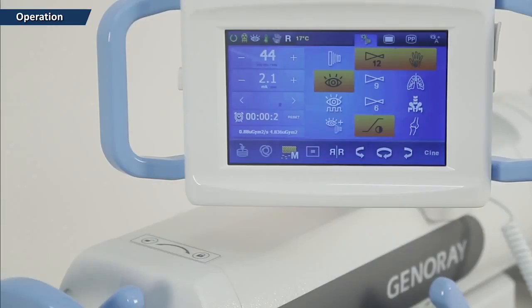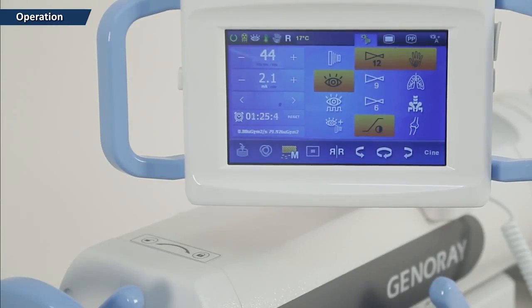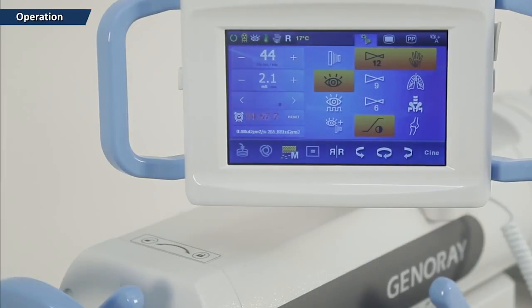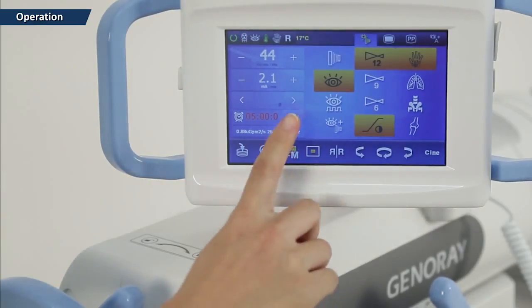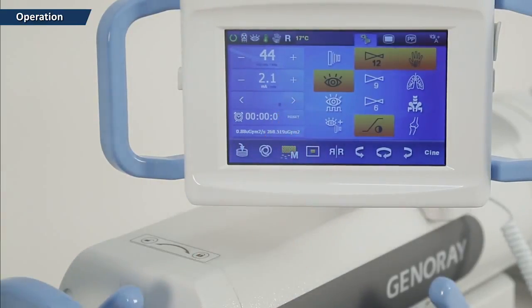The X-ray exposure time indicator refers to the accumulated time only, and you can no longer use the device after a period of 5 minutes. You can use it again after initializing by pressing the reset button.